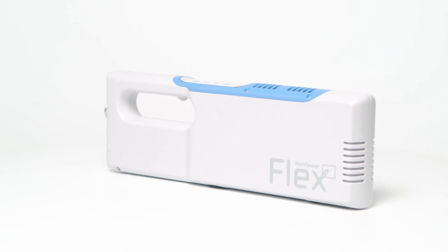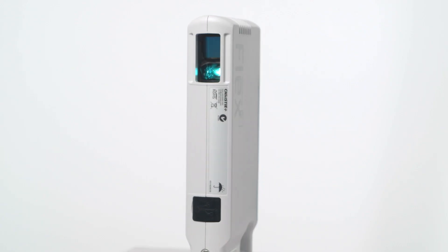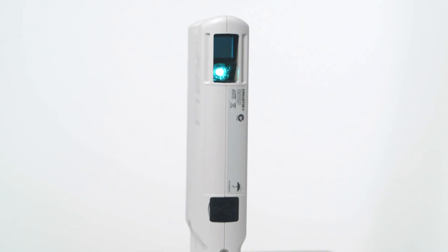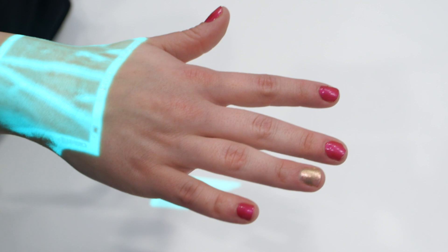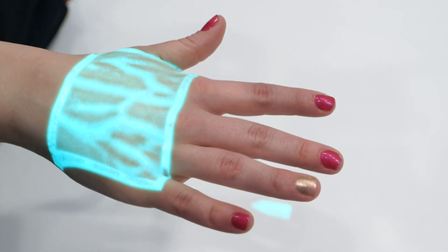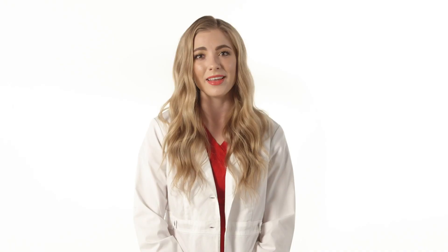The Vein Viewer is a handheld machine that uses harmless near-infrared light that is projected onto the skin. That light is absorbed by blood but reflected by surrounding tissue. The Vein Viewer captures that information and creates an image on top of the skin of the vein pattern under the skin. The image is high definition and projected in real time, creating a perfect image of what you can't see with your eyes.